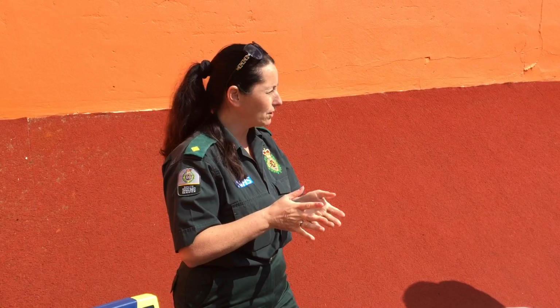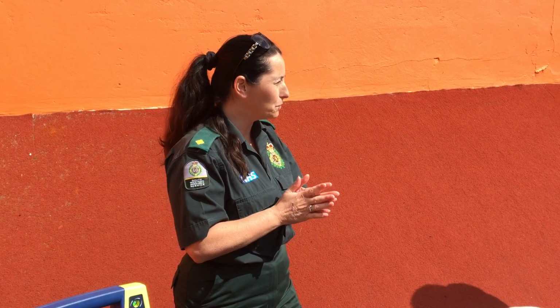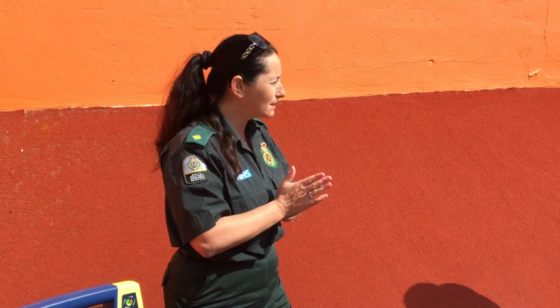I'm just going to do a demonstration on how the defibrillator works. So it's in line with the basic life support and with the safe use of the defibrillator. Please feel free at any point to ask any questions. If you wait to the end, you might forget.